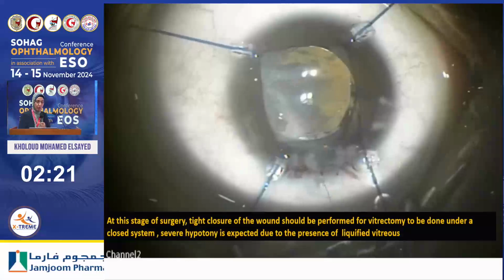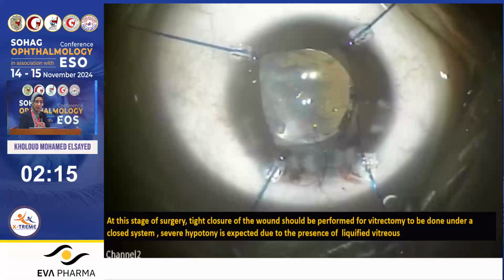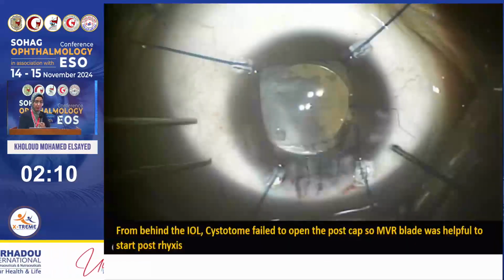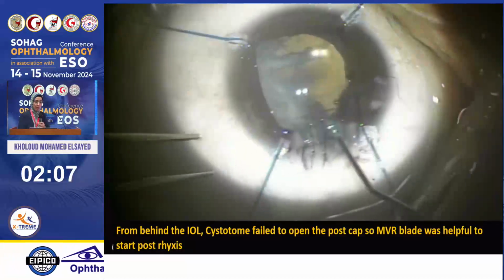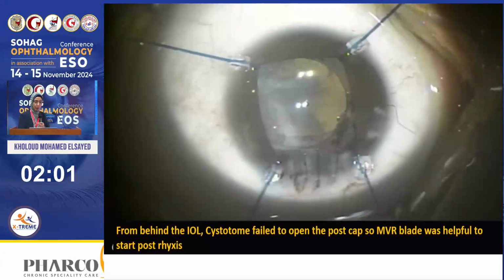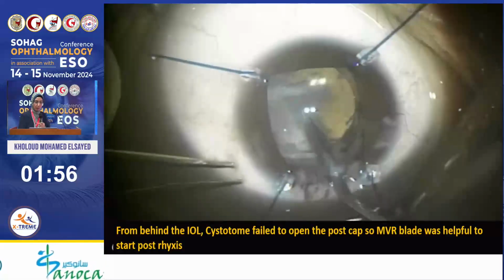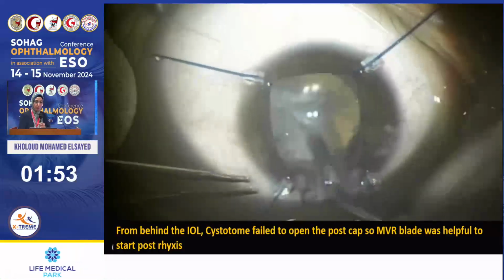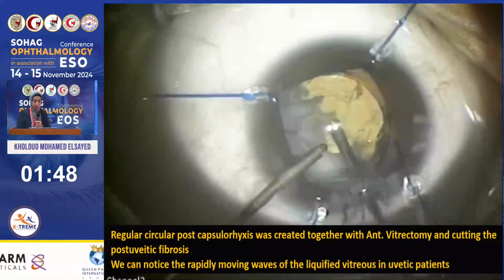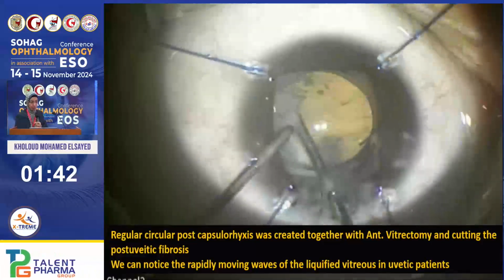At this stage of surgery, tight closure of the wound should be performed for vitrectomy to be done under a closed system. Severe hypotony is expected due to the presence of liquefied vitreous. From behind the IOL, the cystitome failed to open the posterior capsule. So, the MVR blade was helpful to start the posterior rhexis. A regular circular posterior capsular rhexis was created together with anterior vitrectomy and cutting the post-uveitic fibrosis.